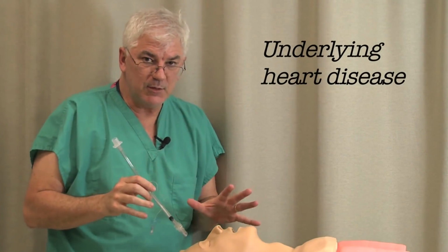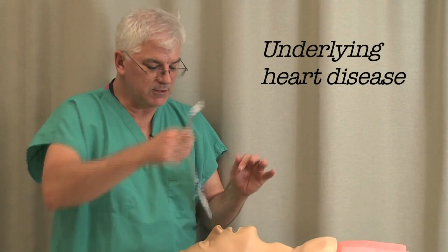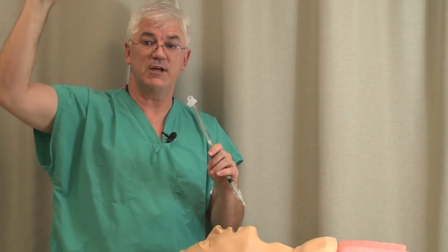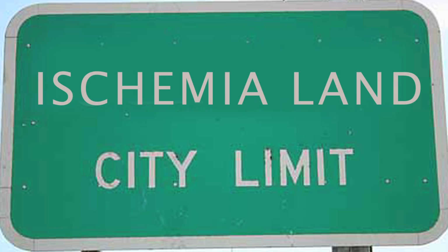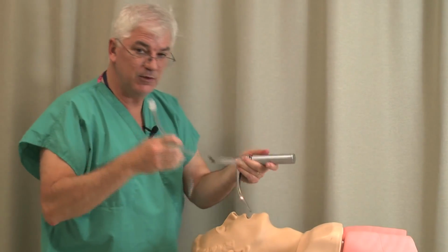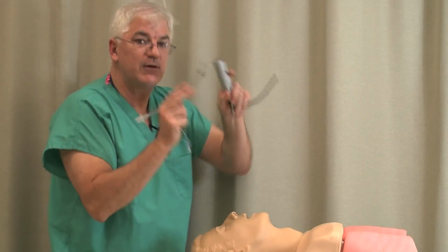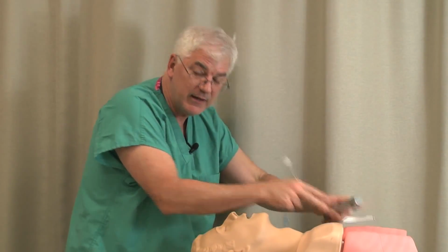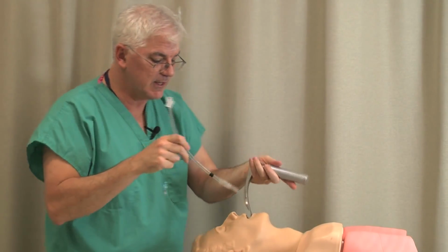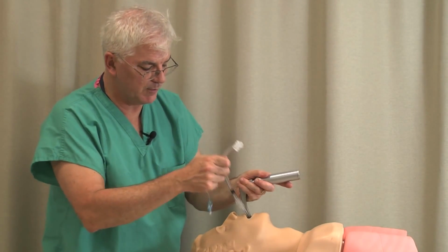If you're nervous about someone and you don't give enough medication to blunt the sympathetic response to intubation, right after you intubate them, surprise, surprise, the heart rate goes up, the blood pressure goes up, and now you might push the person into ischemia land. So very much a part of intubation, we're not just intubating devices. Part of intubating is being aware that I might crash this person on the downside and I might stress this person on the upside because this is a very, very sympathetically interesting time when you're intubating someone.